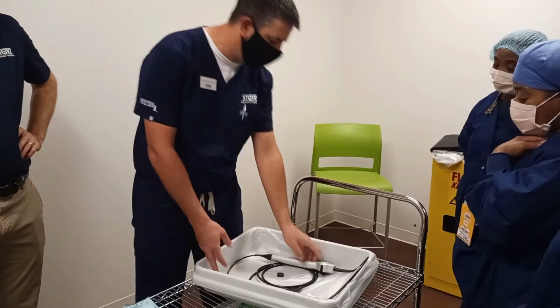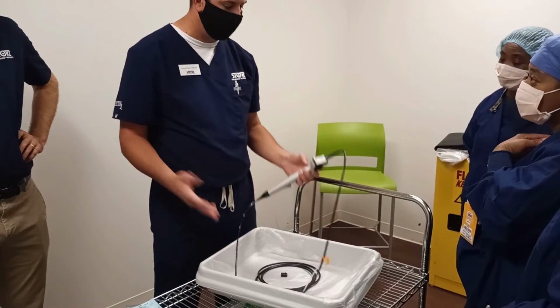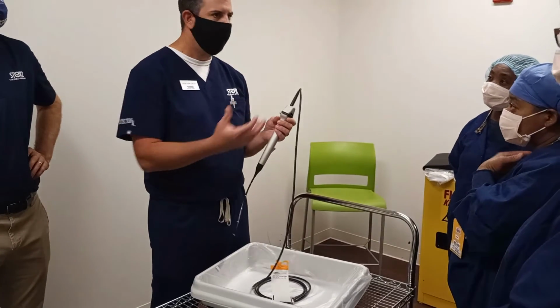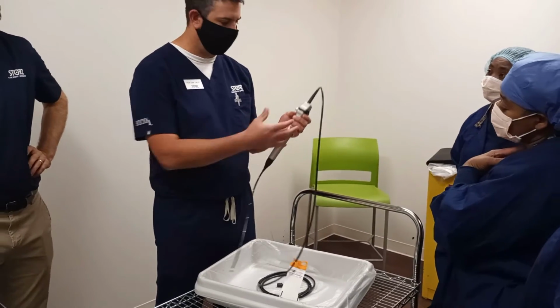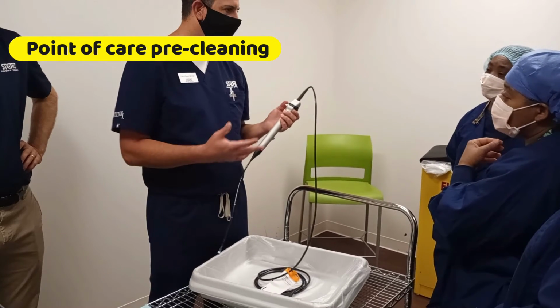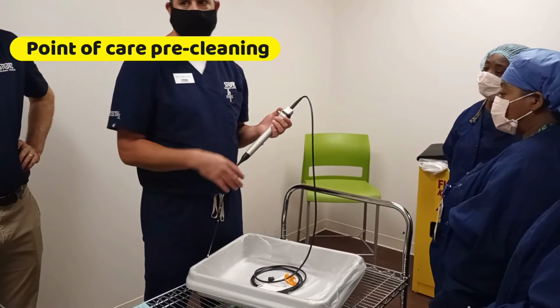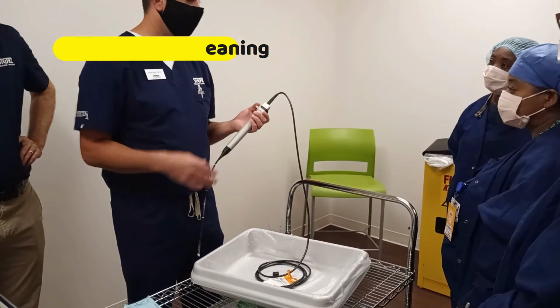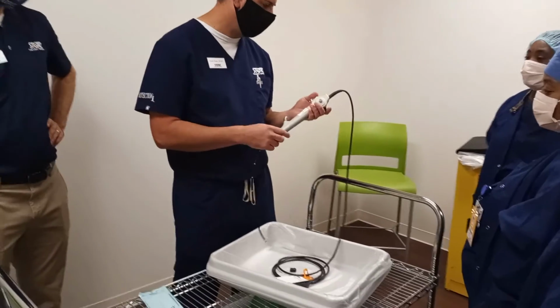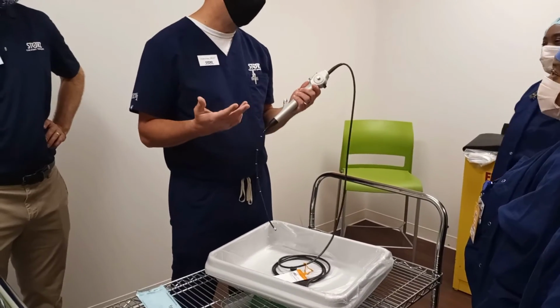Your first thing that should have happened up in the room, they should have done a pre-cleaning to it, right? They should have taken an enzymatic brush, detergent, Raytex, something just to wipe it off, so that it makes your life a little easier when it comes down to decontam, the dirty side, to where you can clean it, right? So the first thing is you want to do a dry leak test, right?